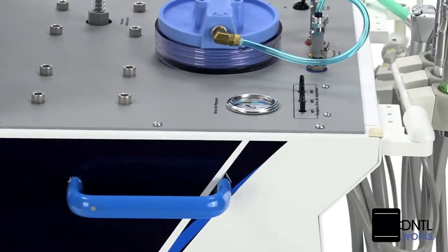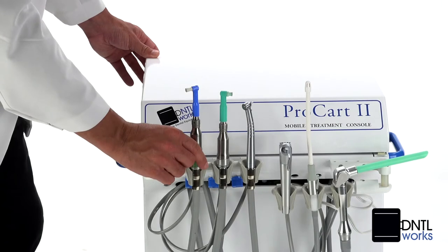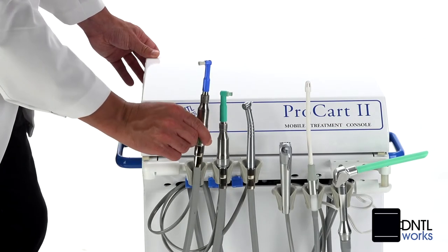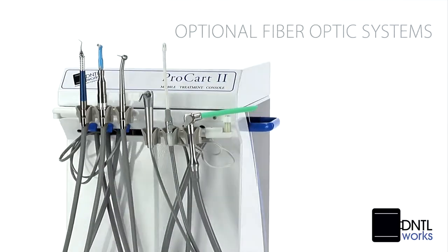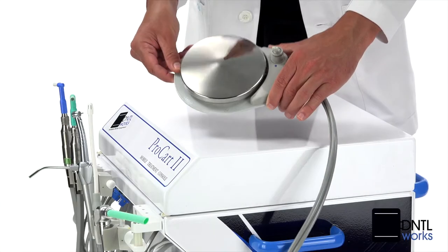Controls are recessed for easy cleaning, and there's an air filter moisture separator that can automatically handle up to three handpieces, including optional fiber-optic systems. You also get a wet-dry variable speed foot control.